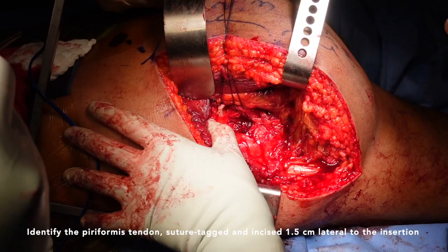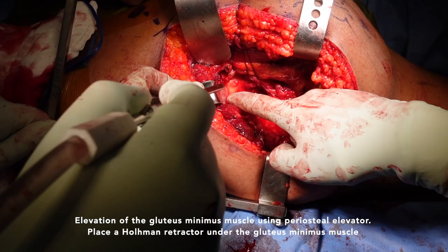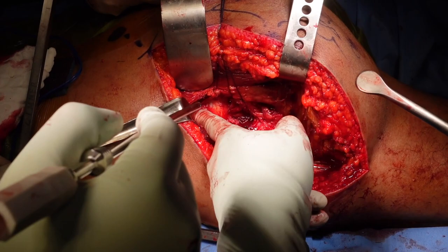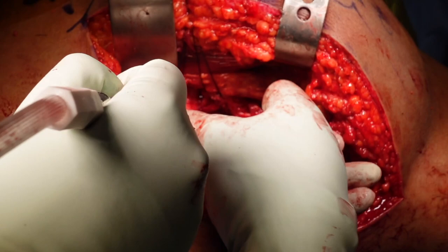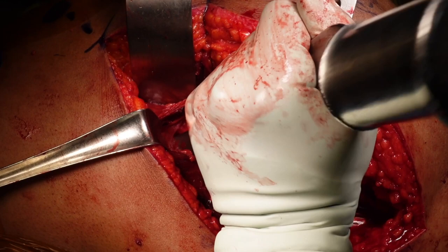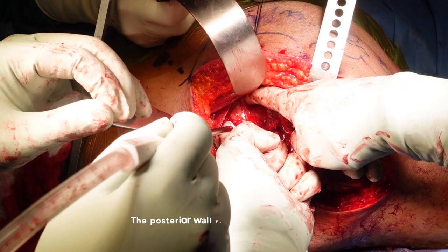Elevate the gluteus minimus muscle using a periosteal elevator. Place a Hohmann retractor under the gluteus minimus muscle. The posterior wall fragment is identified. You can see the exposed femoral head under the fracture.